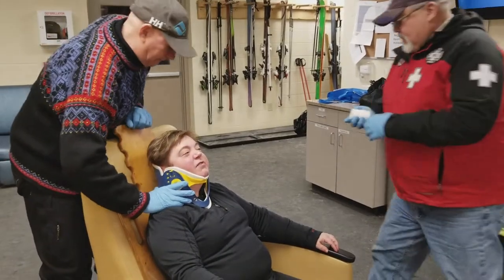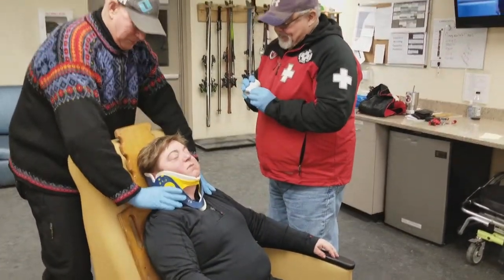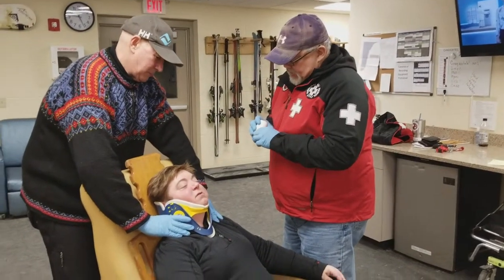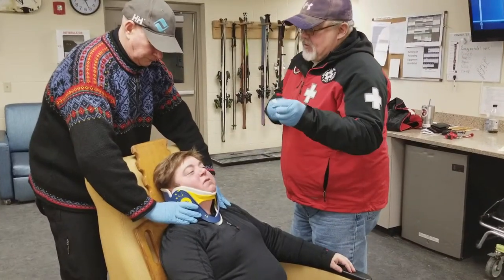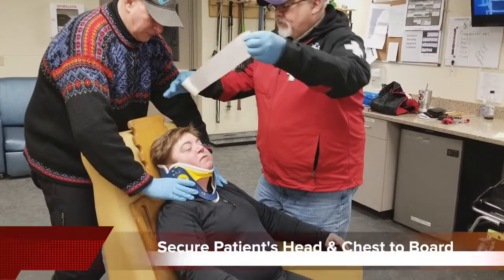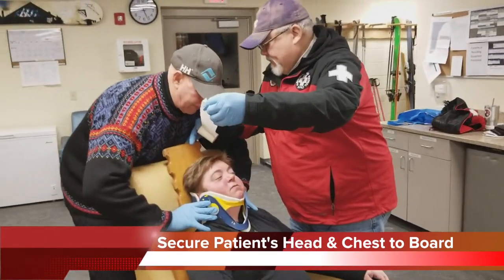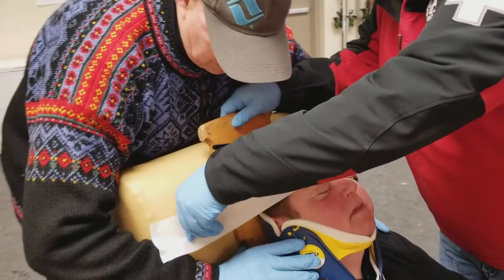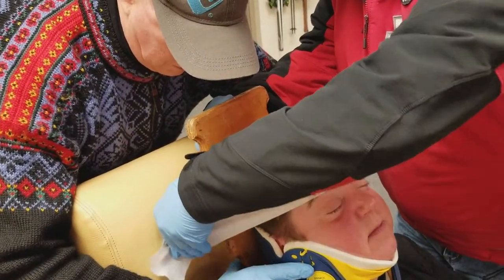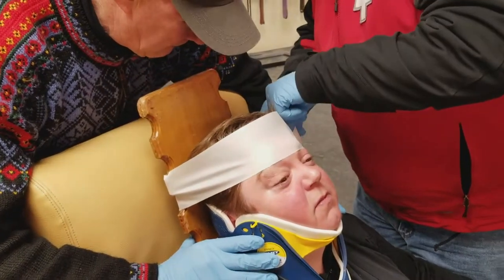Oh, this board actually makes me feel better. Sally, what I'm going to do is put tape over your forehead. If you tape the eyebrows — is this going to take my eyebrows off? Uh-huh. Excellent. I'm going to move it forward just to scope. Did he put tape on her head? Good.